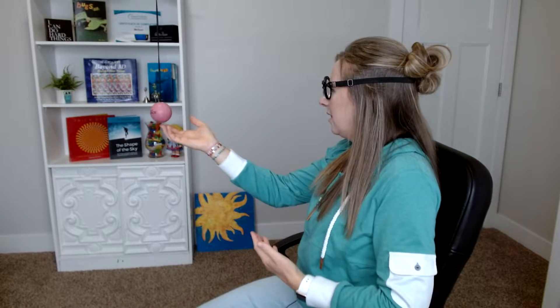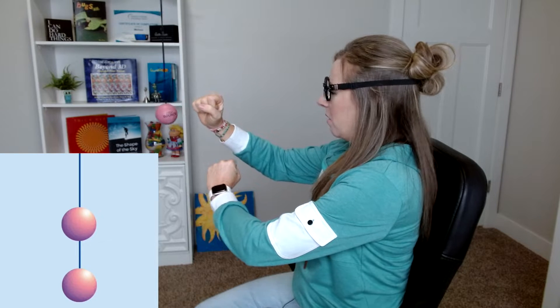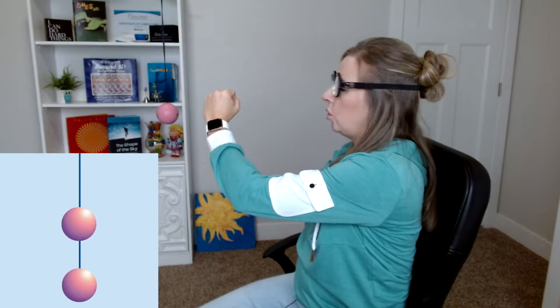Usually when you're using yoked prisms you do them the same direction — both up or both down — but in this exercise you do the opposite. What this does is it forces you to see double. If you have suppression you still might not be able to see two different things, but that's the goal. When you look at the marsden ball, you should see one ball and another one directly below it — one with your left eye and one with your right eye.